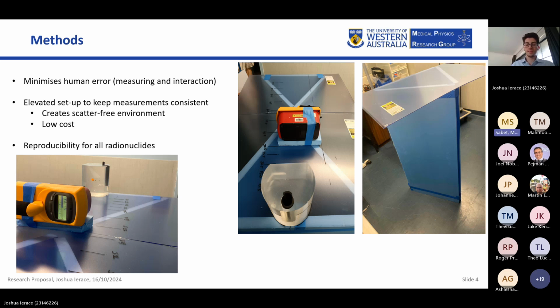So why don't you use the direction that is indicated on it? Because we tried it upways, but it was leaning forward too much. Because the calibration point is about 4.5 centimeters in the center of the detector, I wanted to have it as uniformly flat as possible. So it's just to try and maximize accuracy of the measurement.